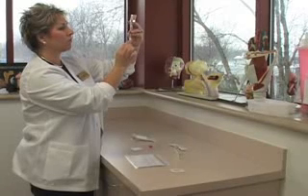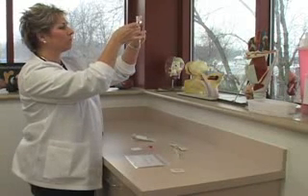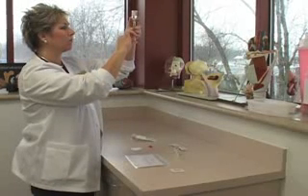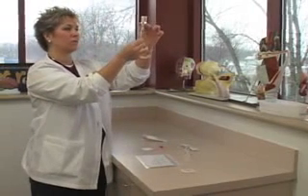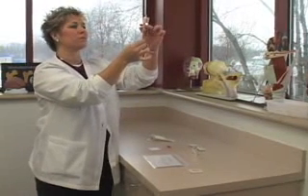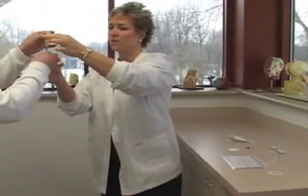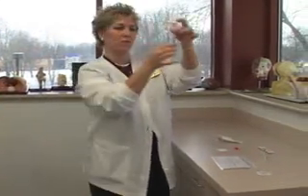Carefully flick the syringe to move the air bubbles to the top and center of the syringe and expel the air bubbles, leaving the needle in the vial. Assess for correct volume of clear insulin in the syringe after expelling the air. Confirm accuracy of dosage with an RN or LPN according to your agency policy.